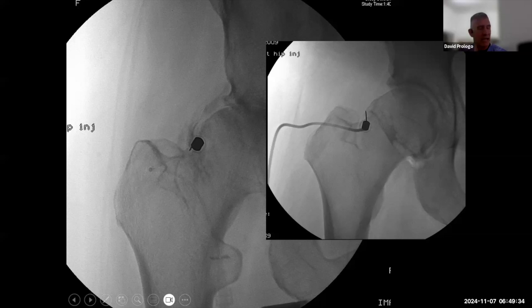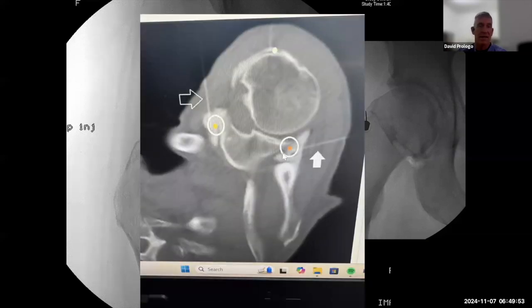But using the same mentality that we used for pudendal nerves, the idea became, why can we not access any nerve that's carrying pain? And now we can access branches of the obturator nerve, branches of the femoral nerve, and ablate them for purposes of hip pain. And here at Muhimbili, this is an image from Alan Sog's paper that demonstrates how we can use CT guidance to access the nerve supplying the shoulder. So the principles are the same here. It's the hip, it's the shoulder, it's the knee, it's pudendal, it's whatever. We can get there with image guidance and do something.